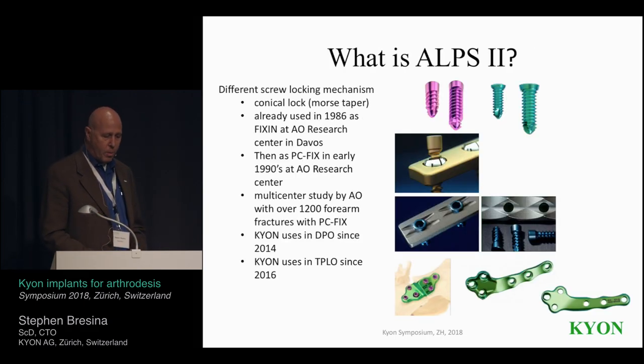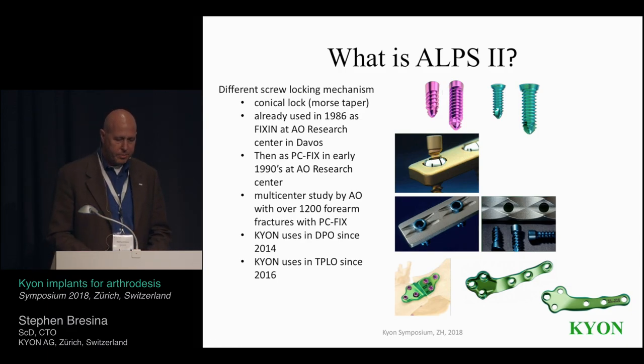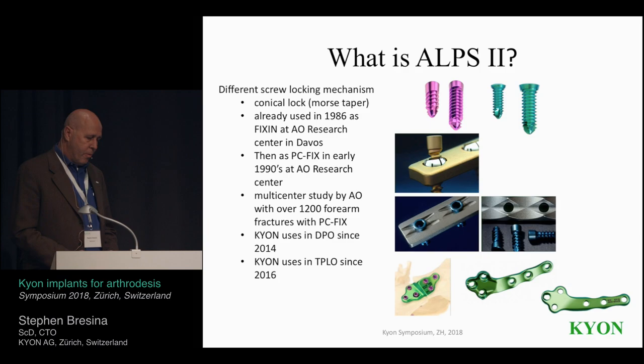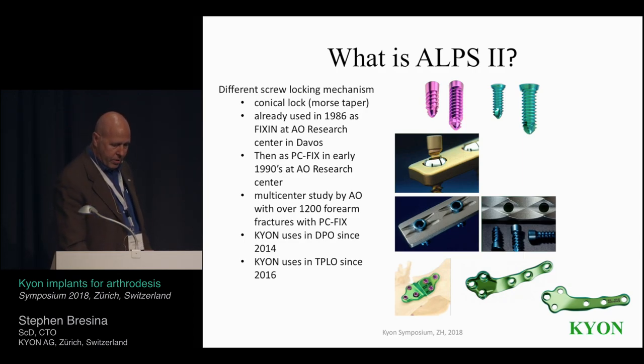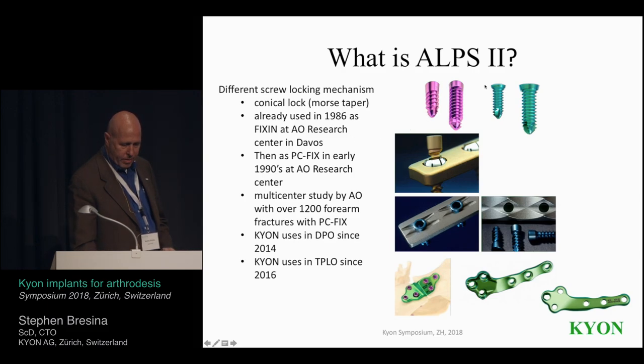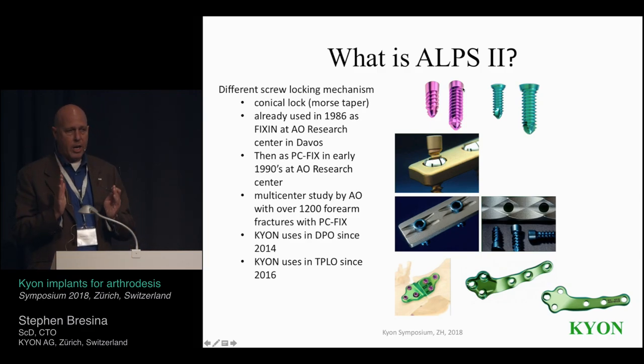So what is ALPS 2? Well, ALPS 2 is going back to the initial taper only, no thread on the locking interface to the plate. We had to go away from that, from PC fix to the first ALPS system that was used at KYON, because of patent issues. And the difference here is, they both look like they have a conical head. They both have threads on the screws, but it's what happens between the screw and the plate that's important. In the ALPS 2, in the PC fix style, the hole in the plate is also only conical.